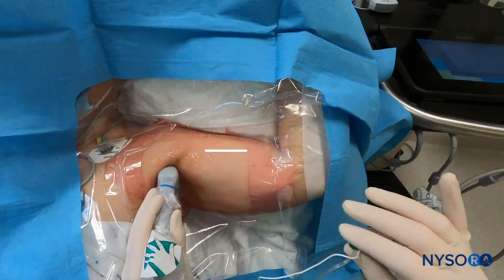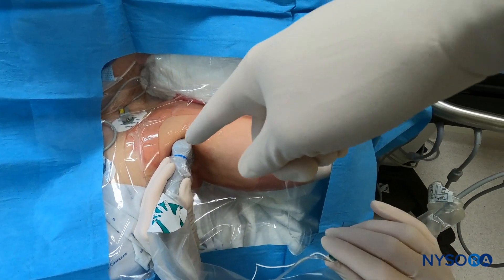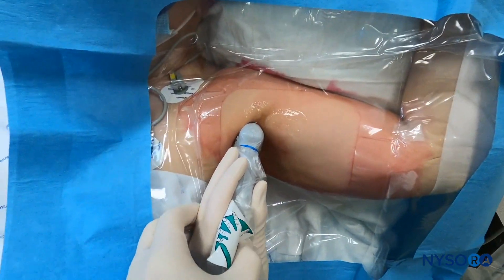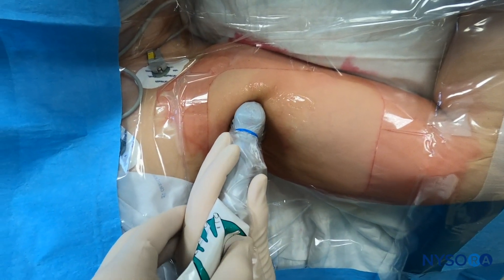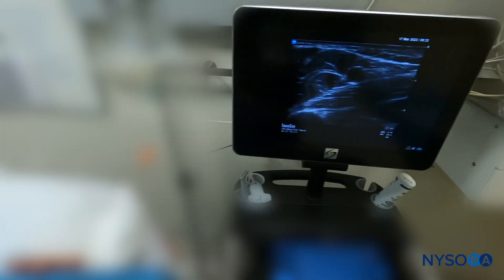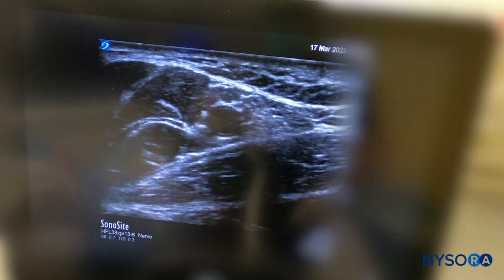We're going to do an axillary brachial plexus block for hand surgery. The typical arm position is abduction with the elbow flexed. This is very important because it allows you access to the axillary crease. The probe position is always in the axillary crease, never looking into the axilla, but rather looking straight perpendicular to the humerus. With that approach, you can clearly see everything of interest regarding the axillary brachial plexus.